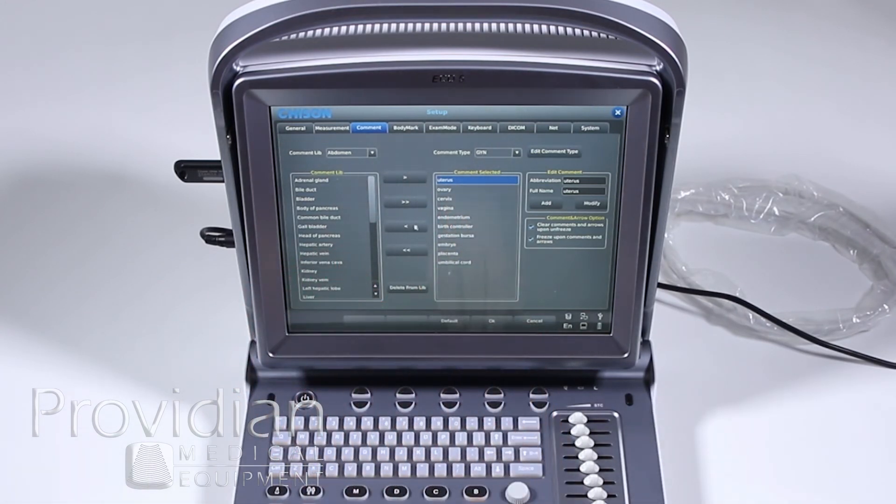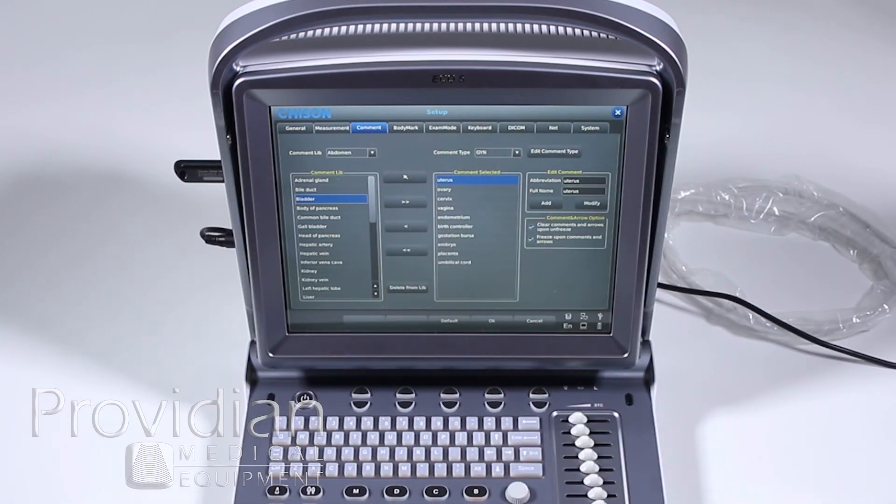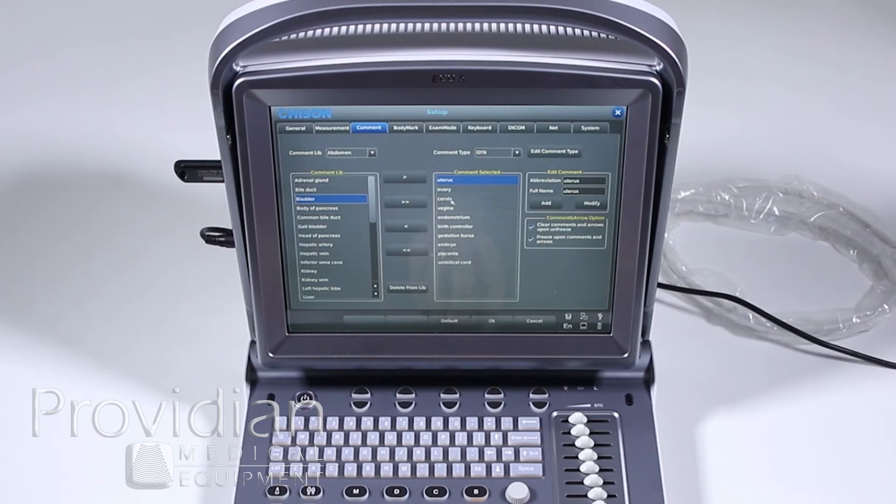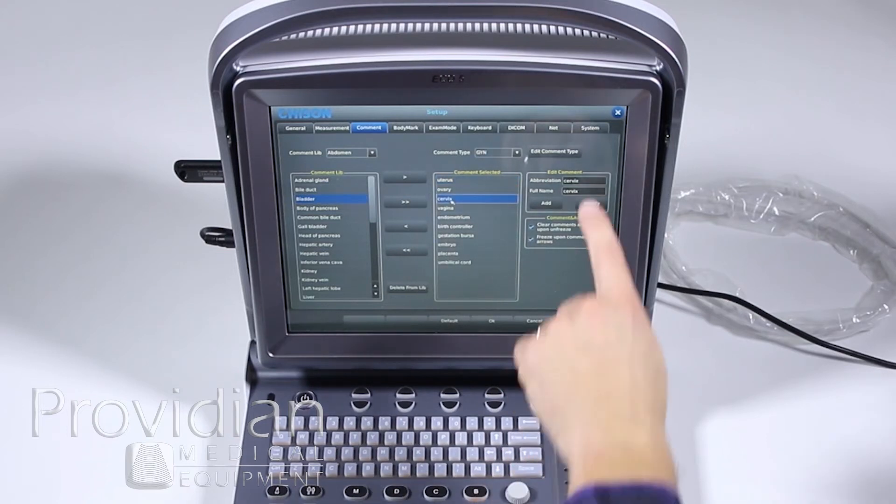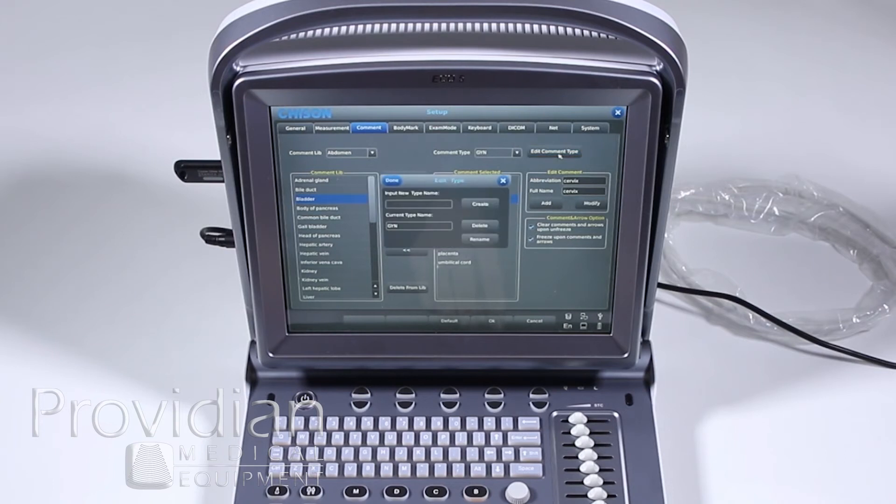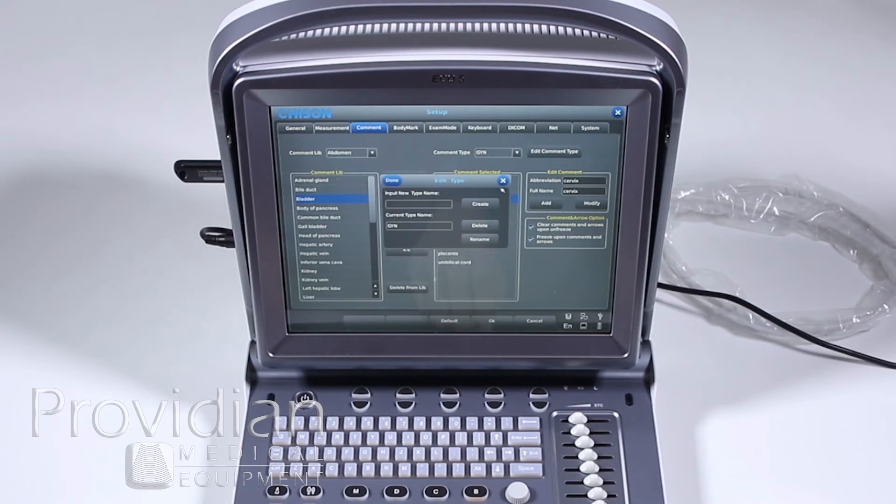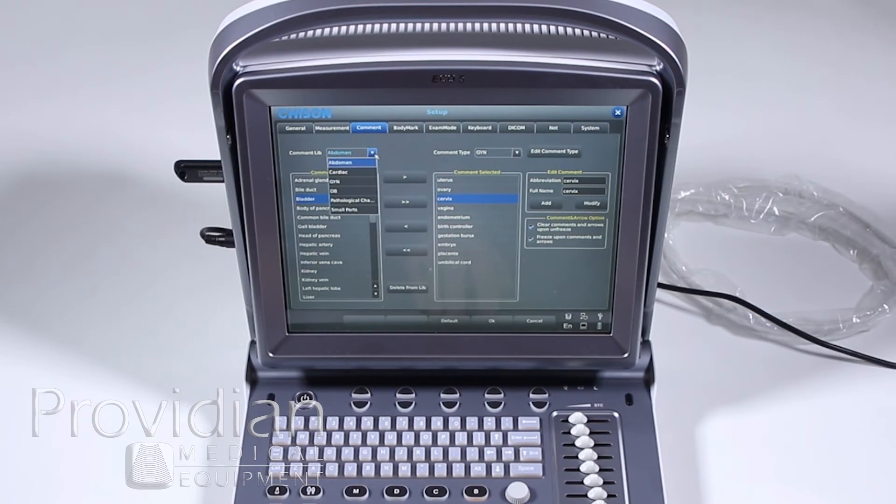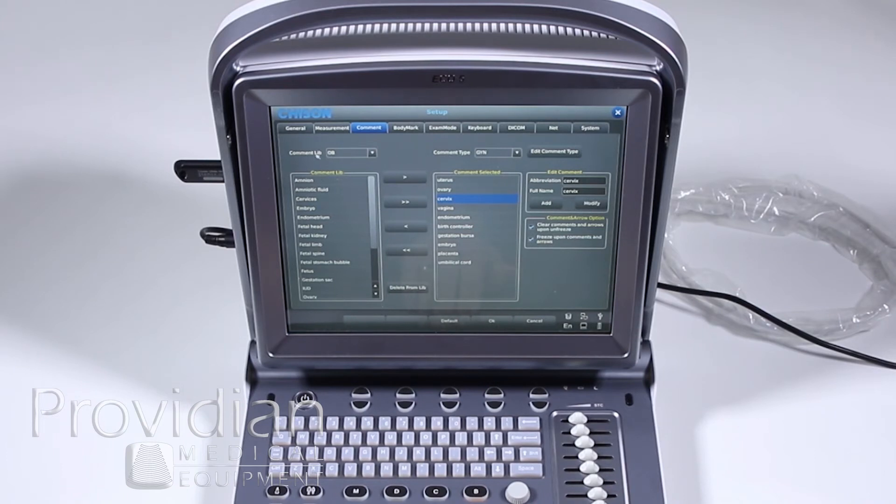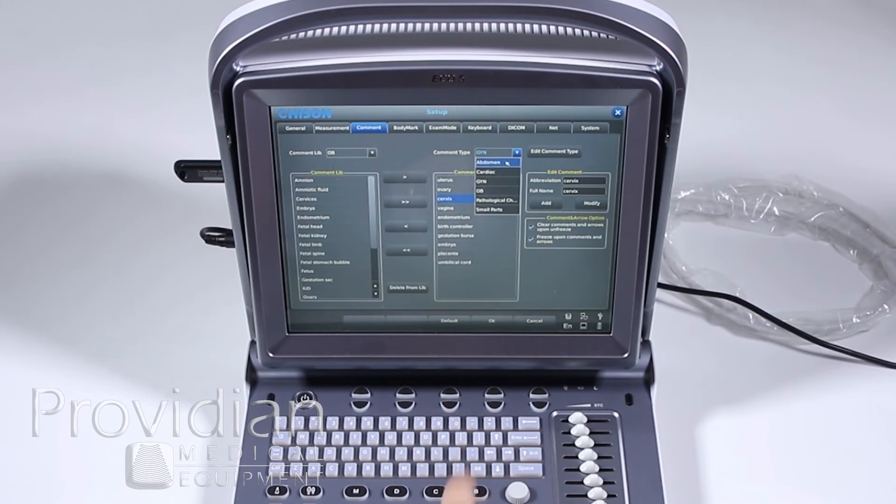You can take them here and remove them by clicking this left arrow and it'll go back to the library. Or you can add them. Say you want bladder on that menu. You can go ahead, click this arrow, and it will add to that. You can also change by clicking these. You can change the abbreviation, what it looks like on there for editing the comment. And here you can put in a new type of comment so you can create your own library.